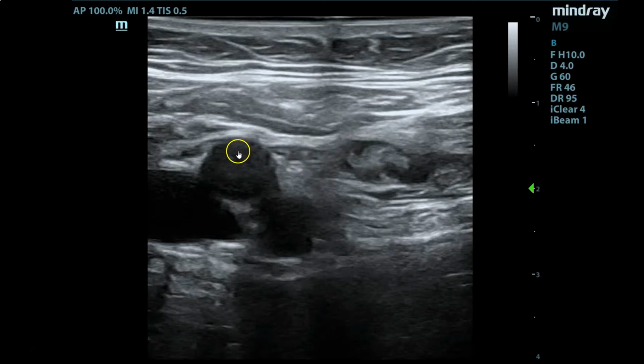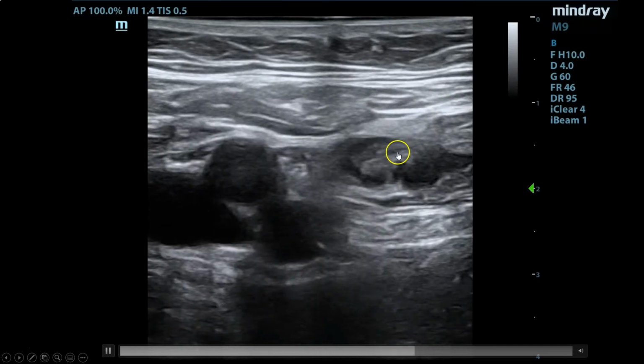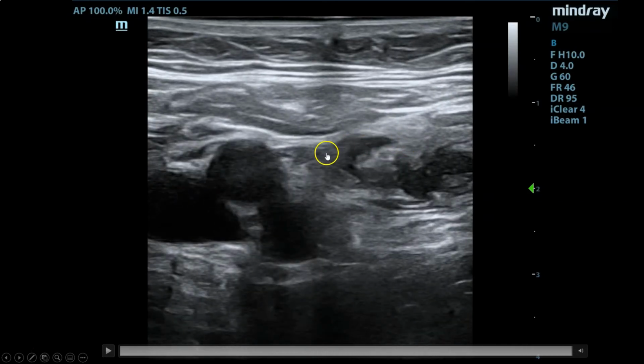You need to be able to recognize what an artery looks like on ultrasound, which is this guy right here, and a vein next to it. So this is actually the femoral nerve right here. This is the femoral artery, the femoral vein. And then if you click through, you'll see right there that the resident is injecting a little bit of fluid right around that femoral nerve, causing there to be some analgesia that will be targeted right to that spot.